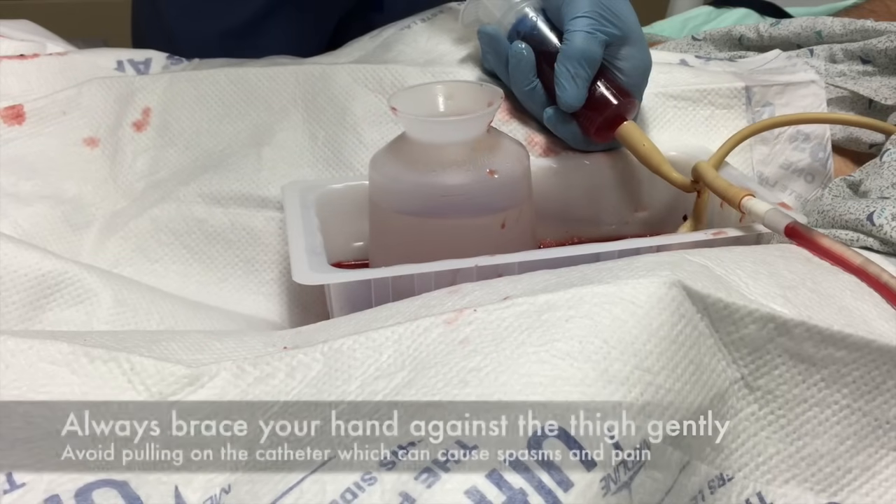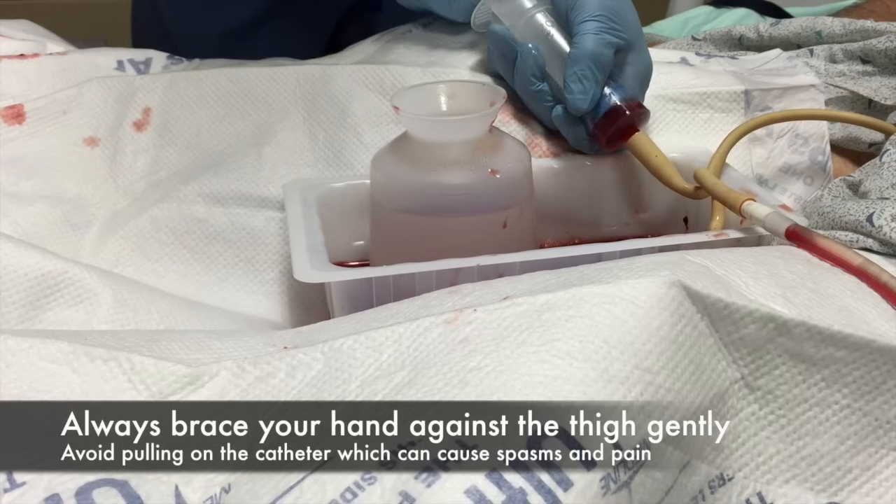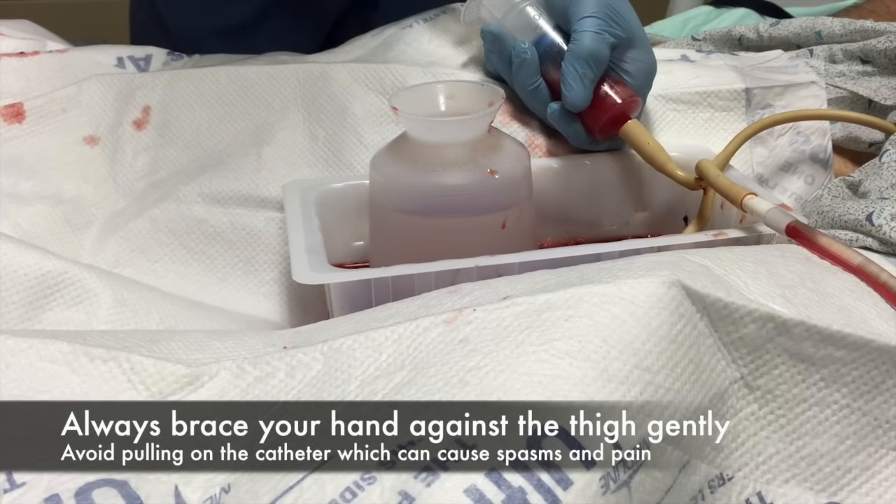Always brace your hand against the thigh gently without making the patient uncomfortable, and always make sure that you don't tug on the catheter as it could cause spasms.